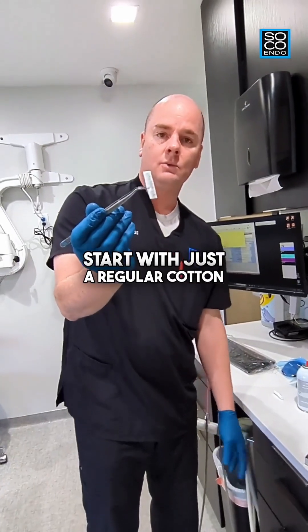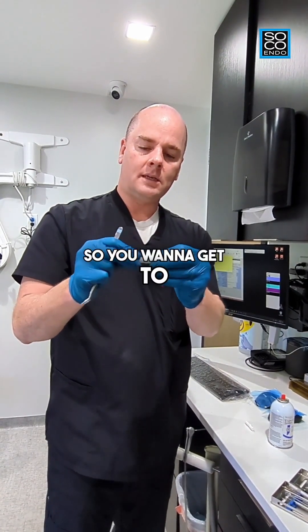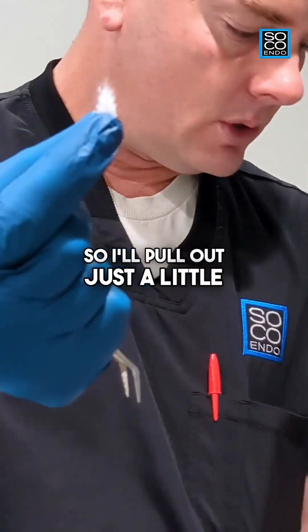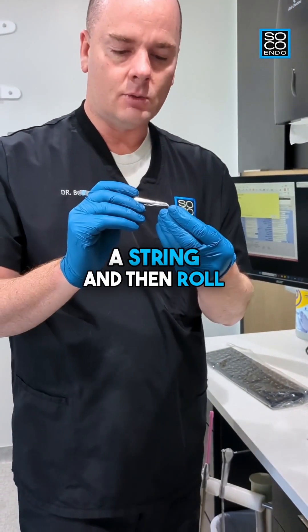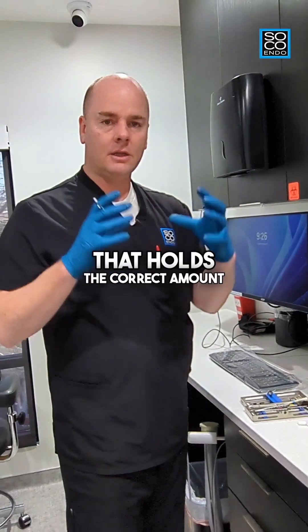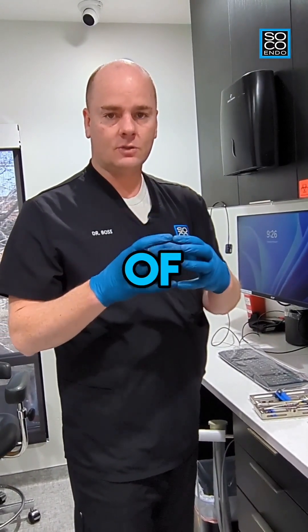Start with just a regular cotton roll. The cotton on the outside is kind of dense — you can tell it's been treated — so you want to get to those nice loose fibers in the middle. Pull out a tuft that's nice and loose and make it into a little ball. The goal is to create a cotton pellet that holds the correct amount of Endo Ice spray.